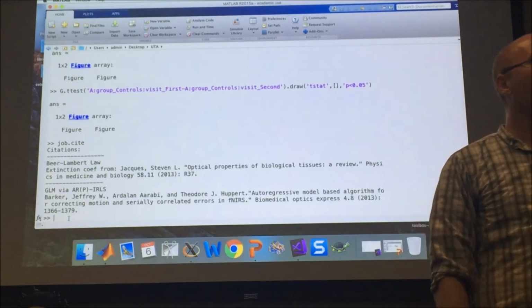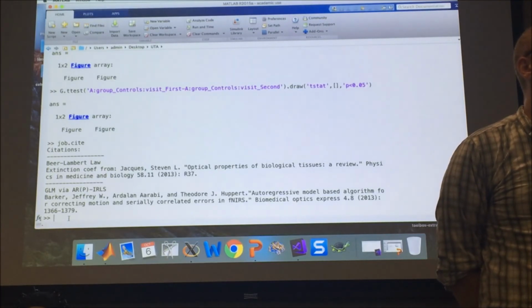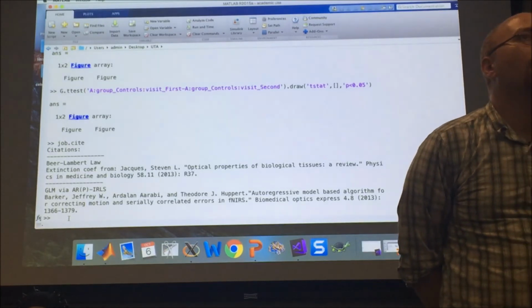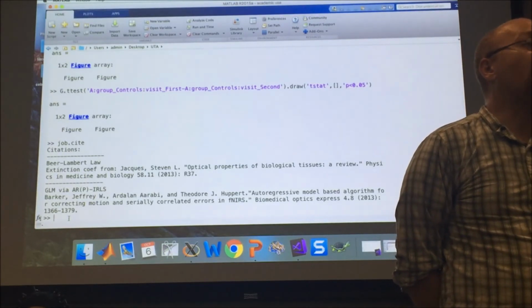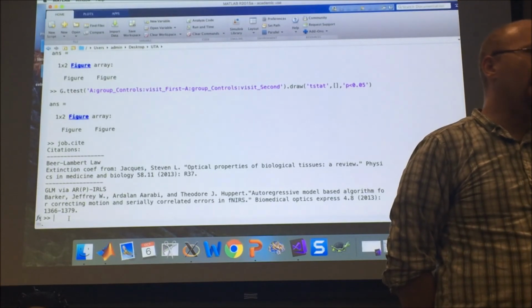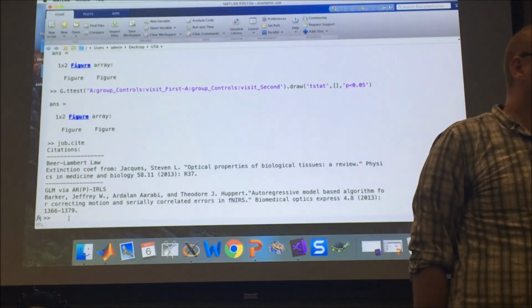Yeah. So, for example, there are several parameters like you said, the subject could have one and kind of random. So, for those kind of parameters, do you have any document? Well, I mean, it's running. That's one of those things I need to put in the reference for when I write up the paper for this toolbox. There are a couple of papers where we've explained what we do because we've used the methods, even though we haven't published the toolbox paper yet.